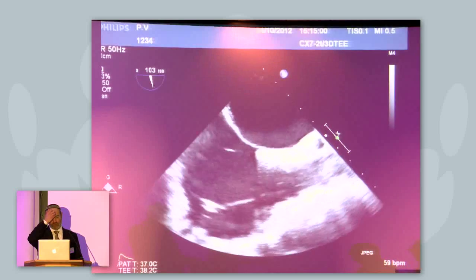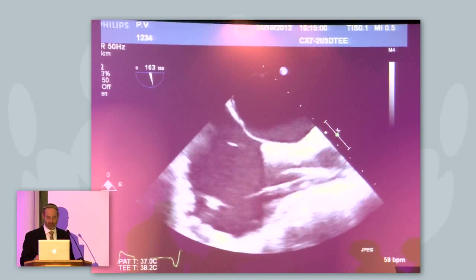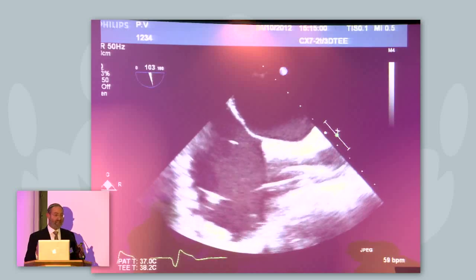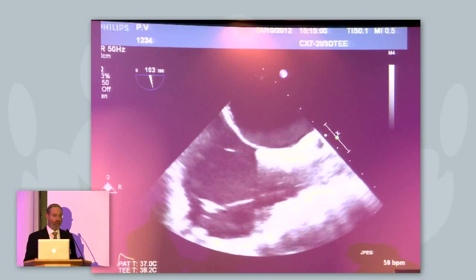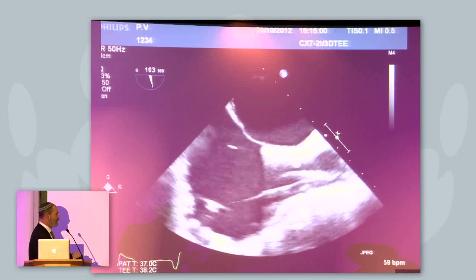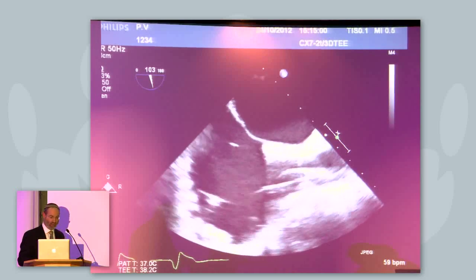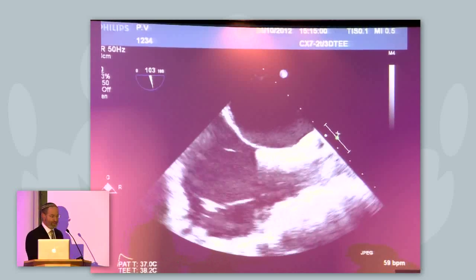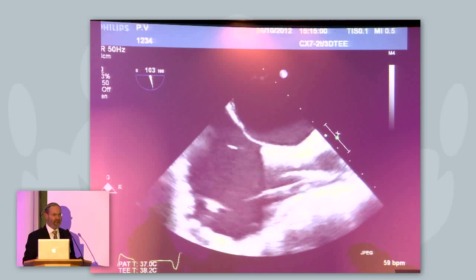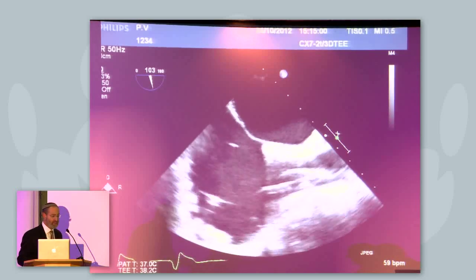The next thing that you want to do in this scanning echo is have a look at the septum, get some sort of concept as to what's going on in that septum, what the septal anatomy looks like, whether there are any things that look like tenting before you put anything there. You can get a good look if there's going to be confusion here, clearly, because there's a pacing electrode running across. Somebody might think that's a wire or that's a needle going across. You can see our needle sitting up here. You can get a look also at the thickness of the septum secundum as opposed to the septum primum, some sort of understanding as to how aneurysmatic it is and how much room there's going to be to puncture on it.